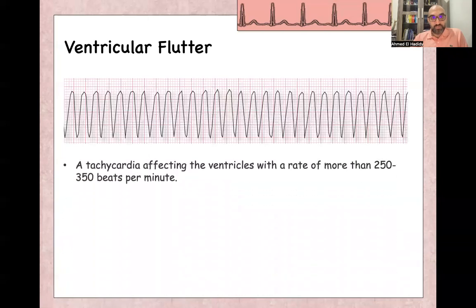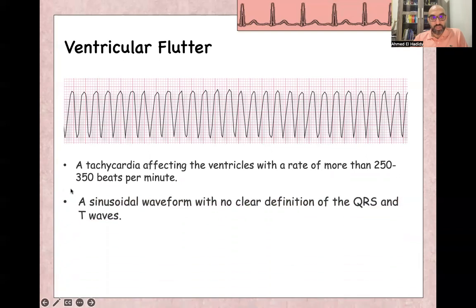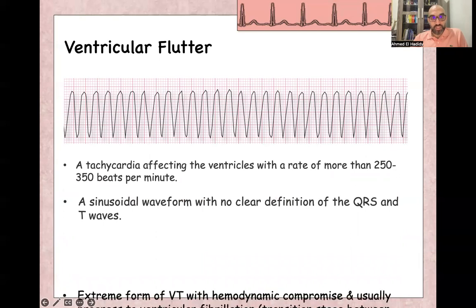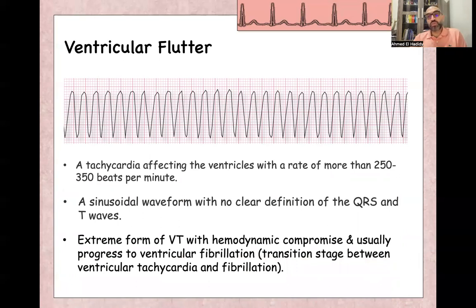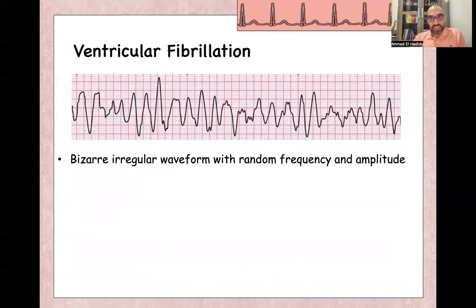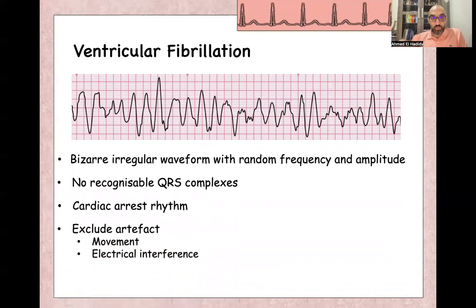Ventricular flutter is a form of ventricular tachycardia with a very fast rate around 250 to 350 beats per minute. You cannot differentiate between QRS and T-wave, producing a sinusoidal waveform — it is an extreme form of ventricular tachycardia that momentarily happens in the transition stage to ventricular fibrillation. Ventricular fibrillation itself is a cardiac arrest rhythm — the patient has no pulse, no carotid pulse. It is bizarre, irregular waveform with random frequency and amplitude, no recognized QRS, no T-wave, no P-wave. Always check and exclude artifact and electrical interference.